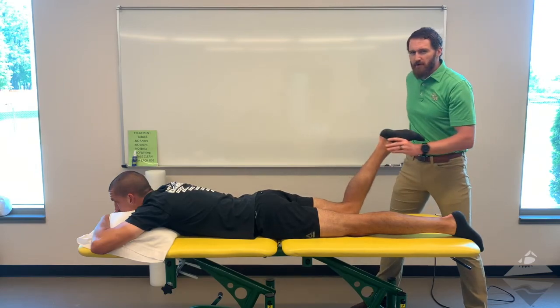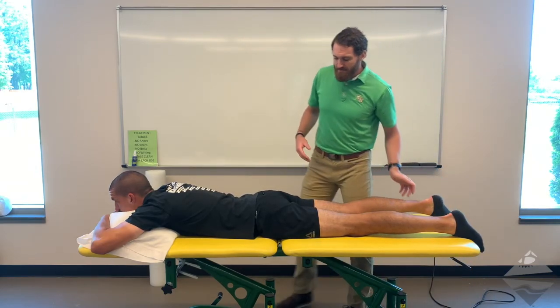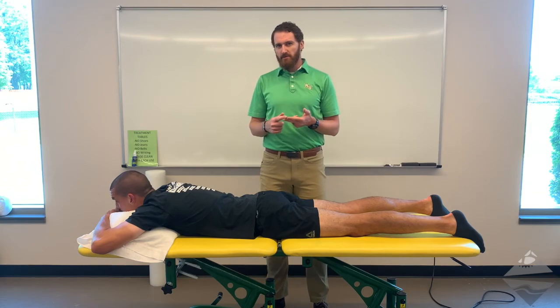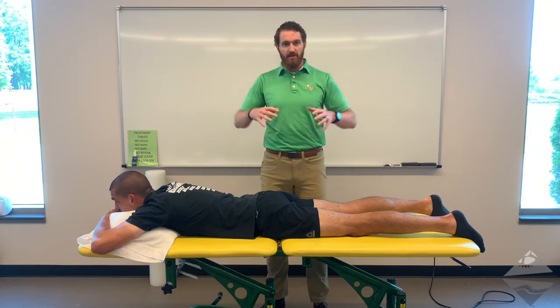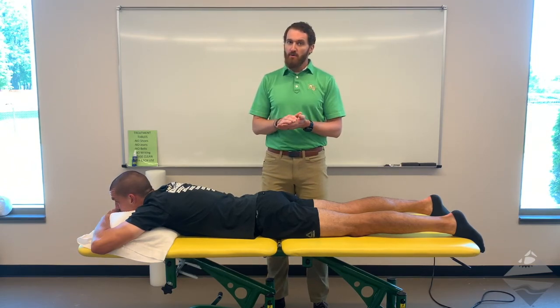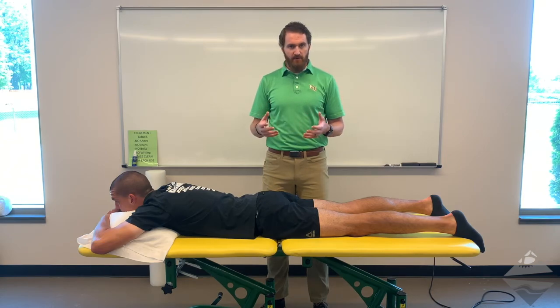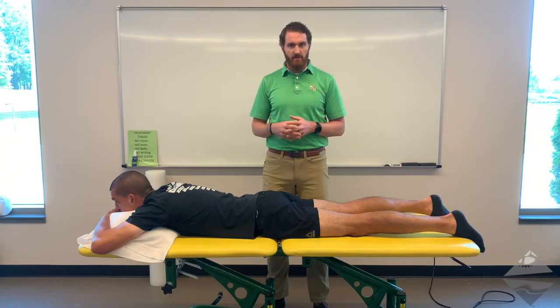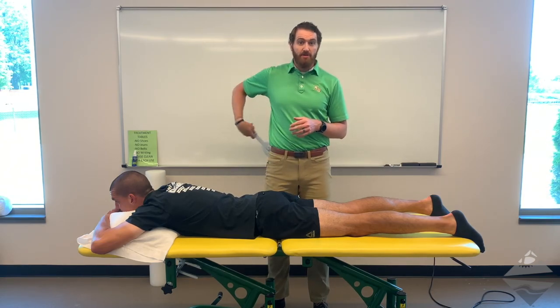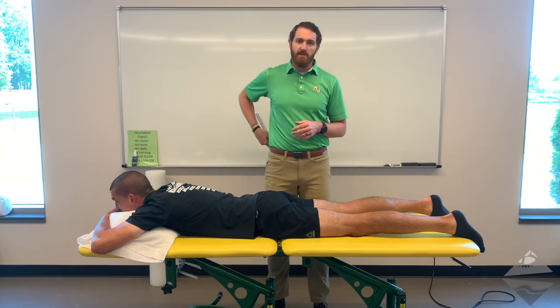You have a couple of different options available. I prefer to assess internal and external rotation as well as flexion all in the supine position. Have a go with a peer or colleague practicing passive range of motion assessment, overpressure, end-feel, and goniometric measurement, and let me know if there are any questions.